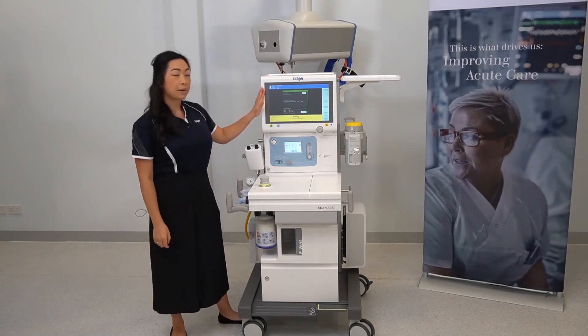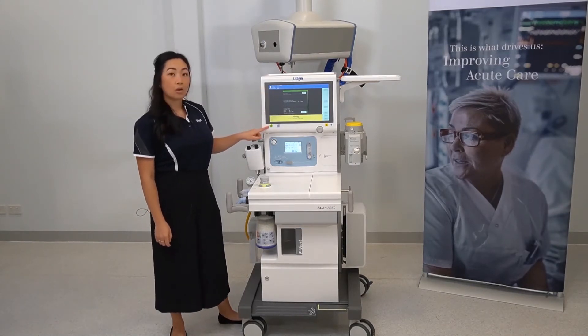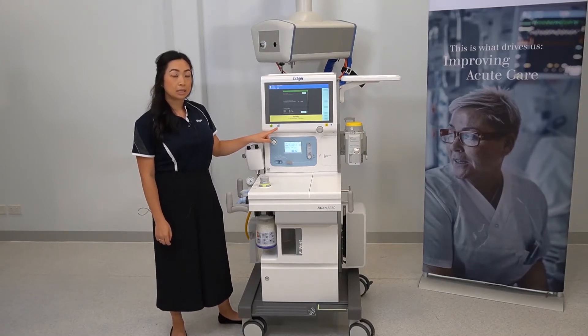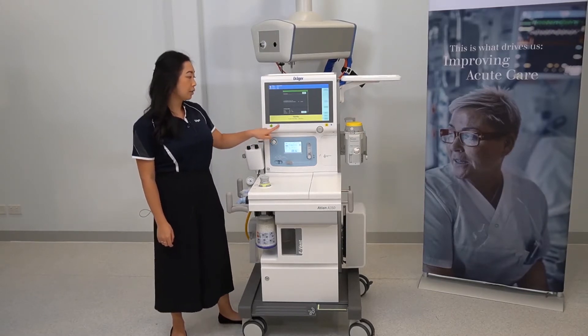This is your main screen, the on/off button, and the light button to illuminate the workspace, which has three different settings.